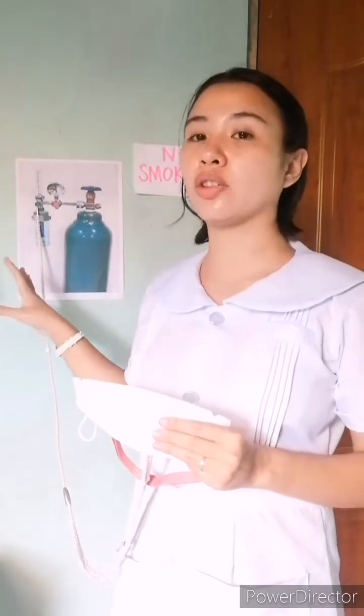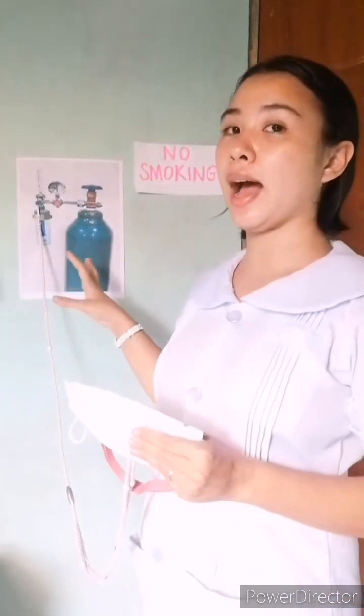Check that the oxygen is flowing freely through the tubing. There should be no kinks in the tubing and the connection should be airtight. You can see bubbles in the humidifier as the oxygen flows through. You should feel the oxygen at the outlet of the mask. Then we're going to set the oxygen at the flow rate ordered by the doctor.